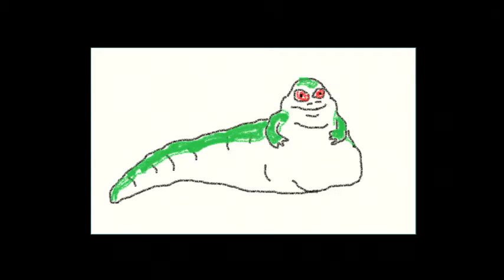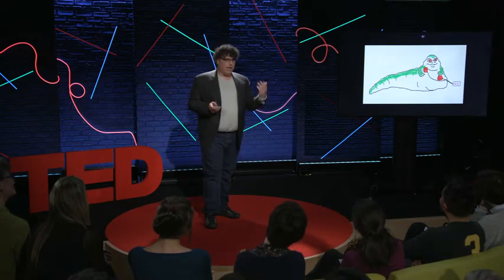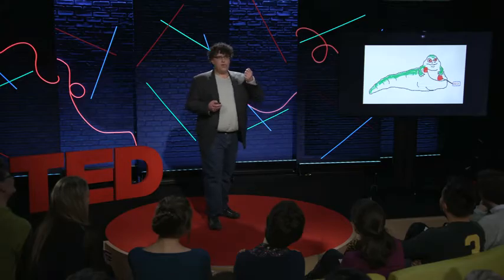Speaking about Jabba, if we do have to use an AED on him, remember pad placement's the same even though he doesn't have nipples. So it's going to be upper right-hand side, lower left. The preferred method, if we're shocking and getting ready to go, after we've done the shock, one of the things we need to do is compression.